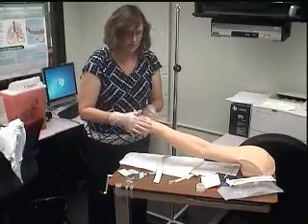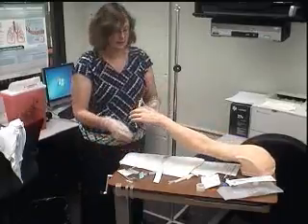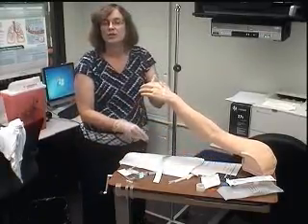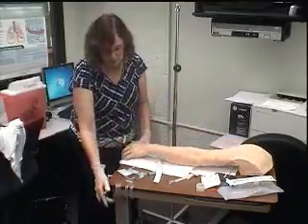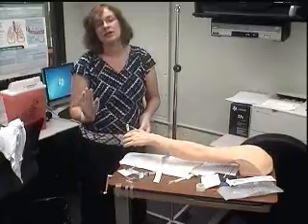And smooth it. Now I have the dressing on, and some people will say, well, that's okay, right, like this. I'm going to have you secure it a little bit more. If your facility says no, you don't need to put any more tape on it, that's fine. Some people will just put tape right on top, boom, and that's it. And some facilities do that, and that's fine.